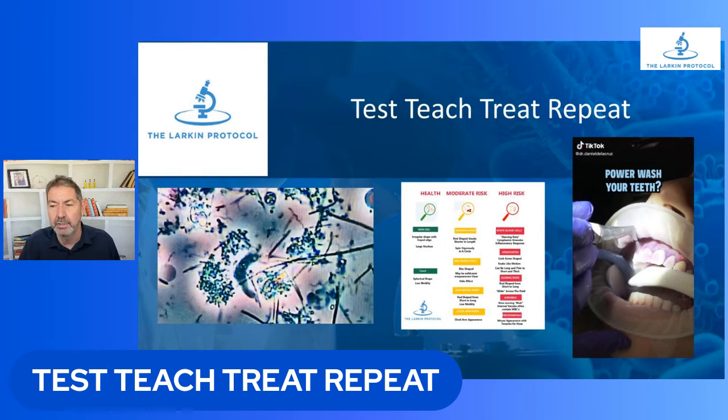And then we come to the treatment side. So the treatment is essentially rinses, antimicrobial rinses. We're getting into the air polishing. Guided biofilm therapy is the EMS technique. Air polishing in general, there's several new things that have come along. Air polishing is a lovely, lovely technique for managing the oral microbiome. And then lasers. And so we're going to talk about lasers. So rinses, air polishing, and lasers are basically the recommended treatment protocols.